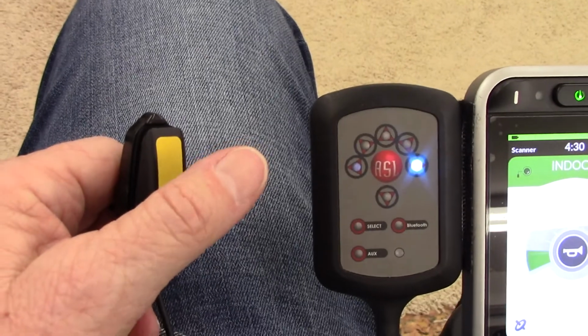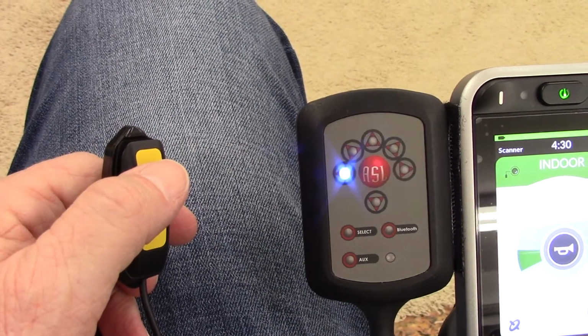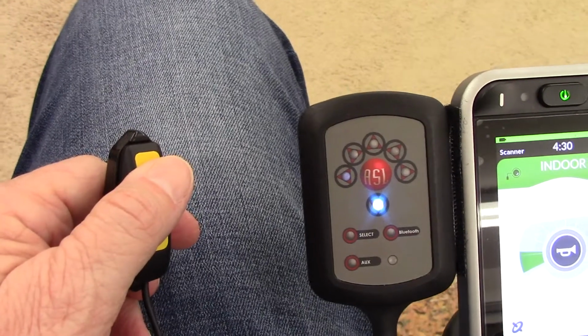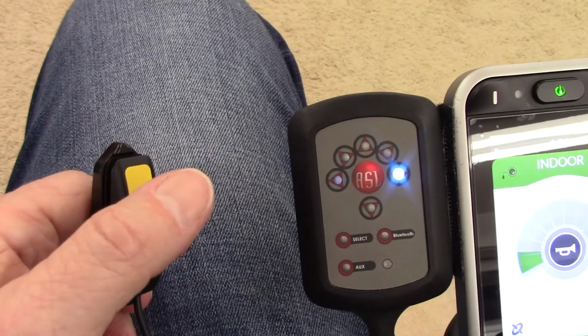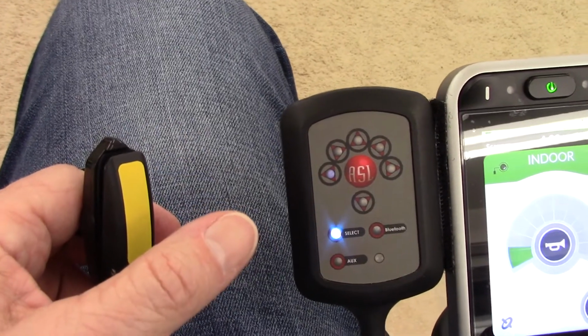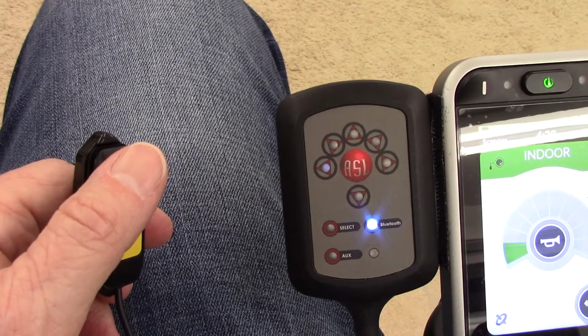Okay, and that's it. I'm holding that switch to make it drive. If I want to back up a little, I'm just going to back in here. Okay, and when I let go, it stops and the scan begins. So this is not driving in latched. I am holding on that switch to keep it moving.